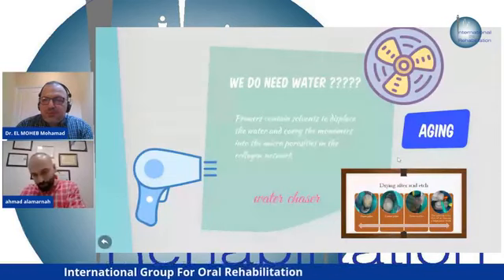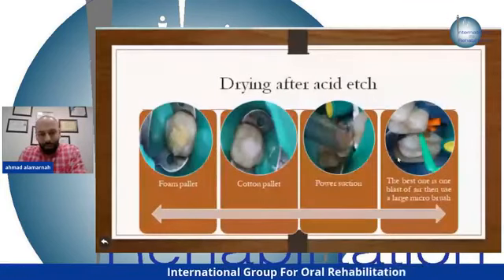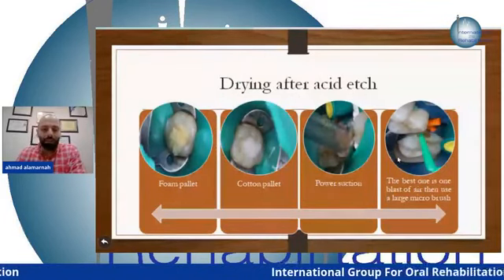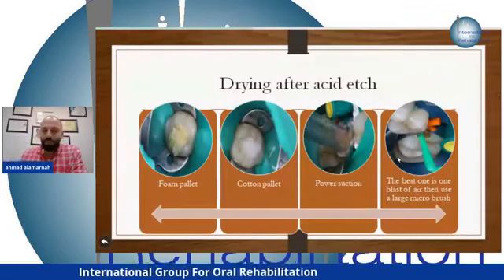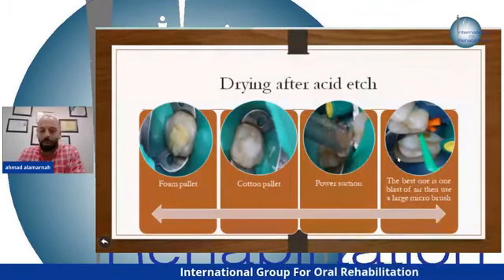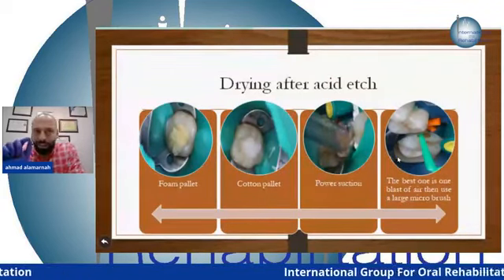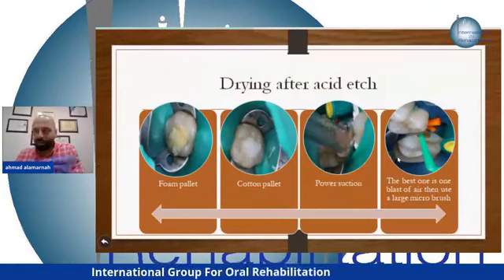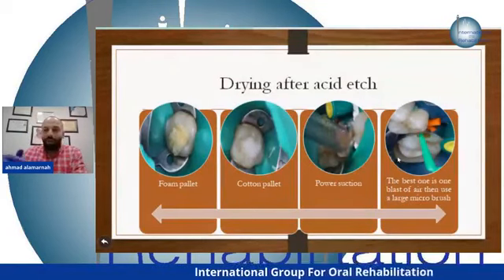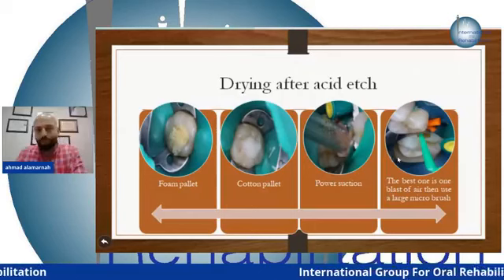Okay. So, do we speak about the drying procedure? Do we need the tooth to be very dry or what? We need to have some wetness, some fluids within the dentine mainly, not the enamel. The enamel, you have to have the chalky white appearance, it's up to you. But for the dentine, we have to make it a little bit wet. I call it a dry wet, not wet and not dry, not chalky white like a chalk, okay? It will be a dull appearance. It will have some water, but not too much water, not glossy.